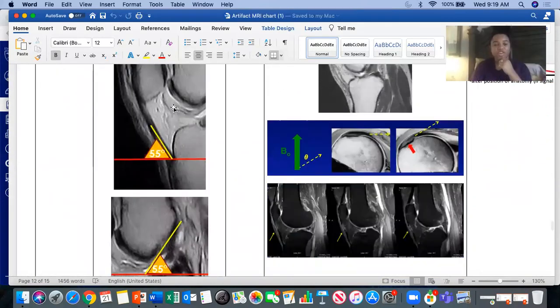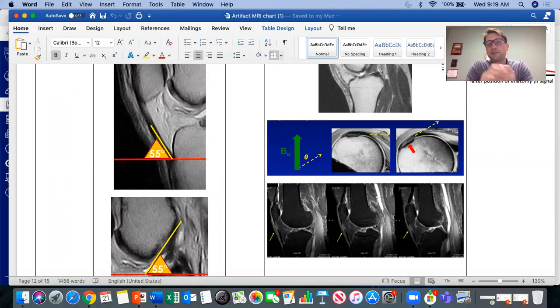And this is when the patient is angled in the scanner? Yeah, I mean, it's just their anatomy's angled in the scanner, 55. The knee, it seems odd just because typically they're in a knee coil that's kind of running perpendicular. But sometimes you have to put them in a flex knee coil and have them kind of in a weird position. So that can cause that artifact.